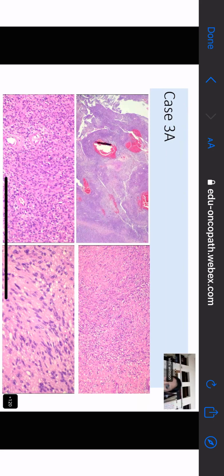It is arising from the periendothelial cell. So you think it's a hemangiopericytoma or a myopericytoma, or what? Glomus tumor, ma'am, glomangioma. Glomus tumor. Okay. Very good. Anybody else?